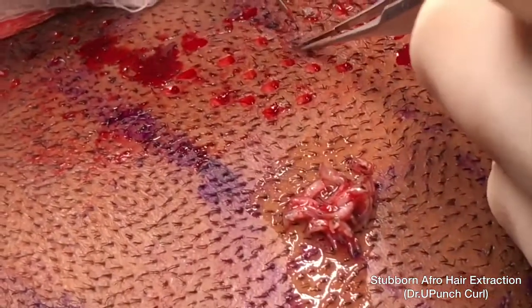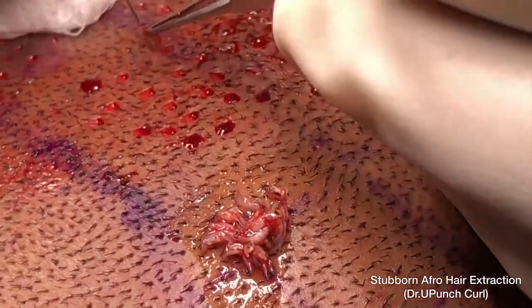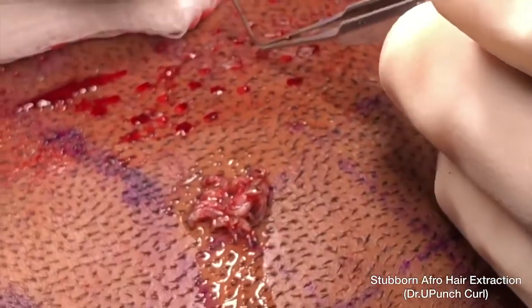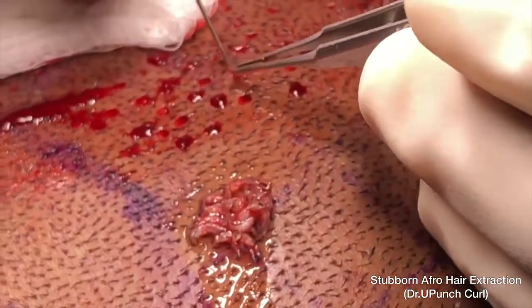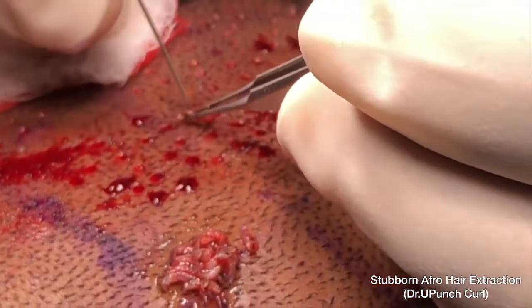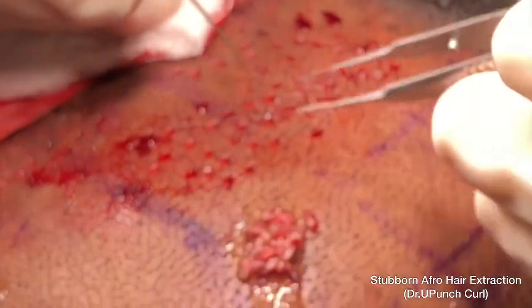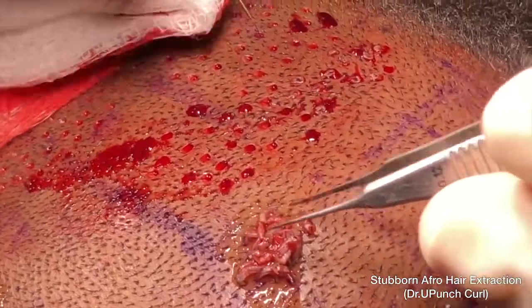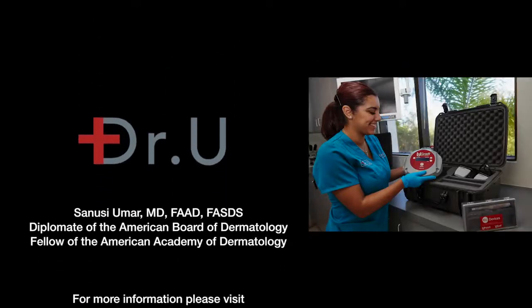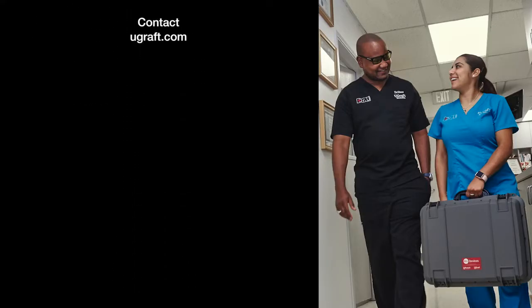As we can see here, all the grafts are intact, and they are quite circular or semi-circular. The Dr. U Punch Curl 2.0 is the one that will be available to all FUE practitioners because of its more user-friendly design.